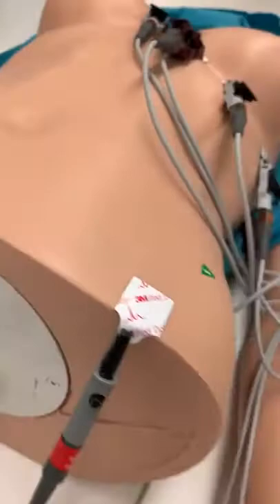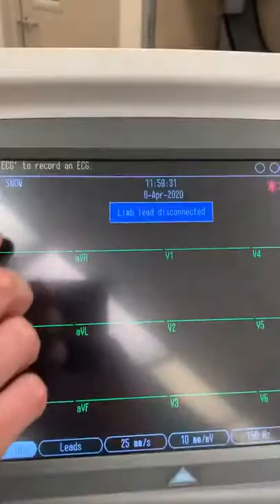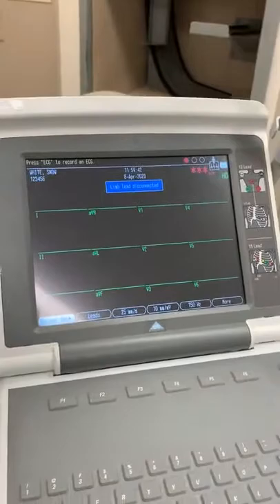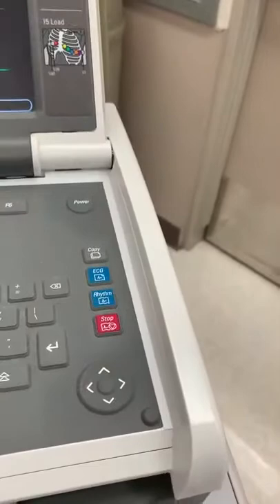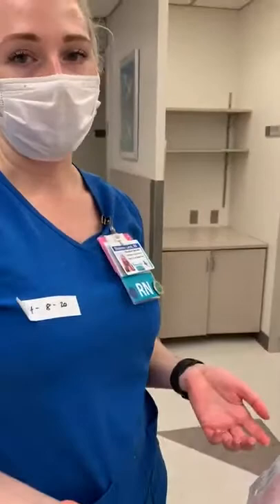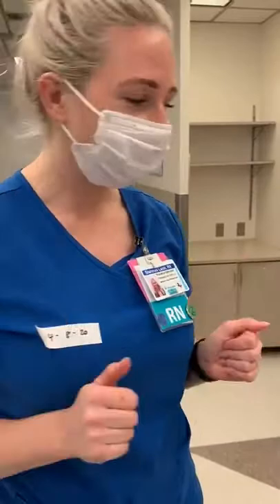We'll come over and look at our screen. We want to make sure that lead one has a positive QRS complex, AVR has a negative QRS complex, and that we see tracings on all of our leads. Once we're happy with that, we'll ask the patient not to talk and not to breathe — to hold still for about 10 seconds if she can tolerate it. Then we'll go over and hit our ECG button, hit continue, and we'll get a nice printout of our ECG. That also saves a screenshot of your ECG in the machine, which takes you to your next step — transmitting the EKG, which uploads it to the patient's chart and it will also be billed to the patient.